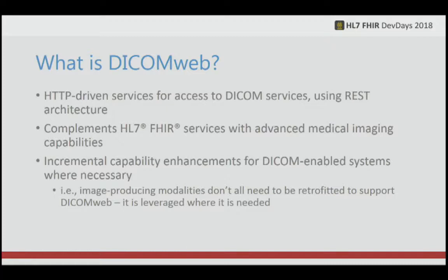We've worked very closely with FHIR to make sure that these things are complementary, not stepping on each other's toes, but actually working together to give you the best value for calling these APIs. It also sits on top of existing DICOM systems where plausible, so that you can use DICOMweb and still talk to DICOM backends if you've got some sort of proxy in the middle.